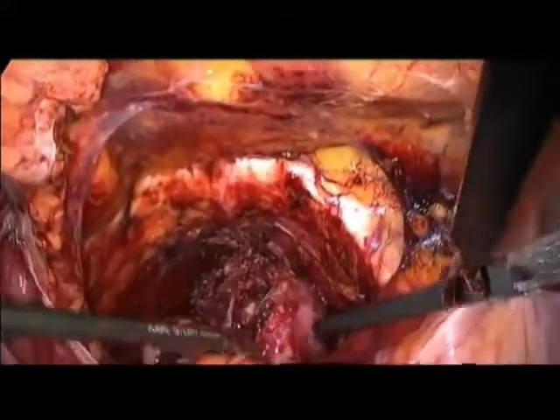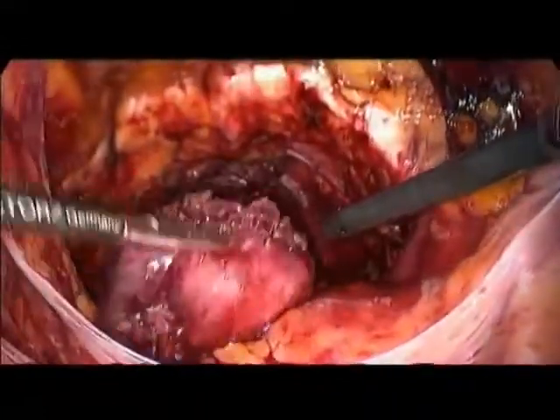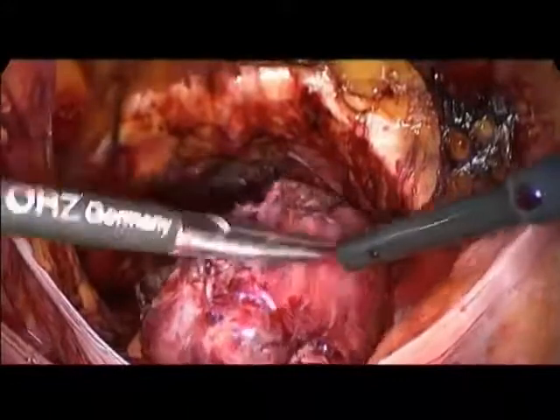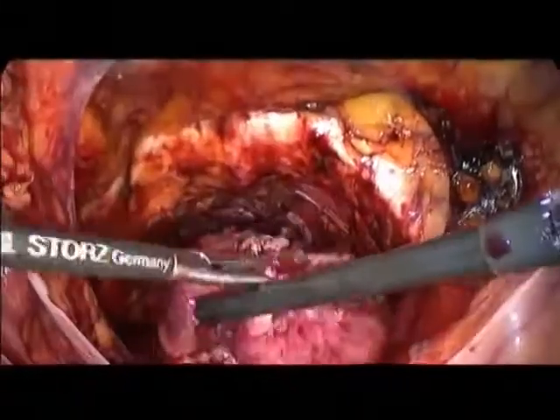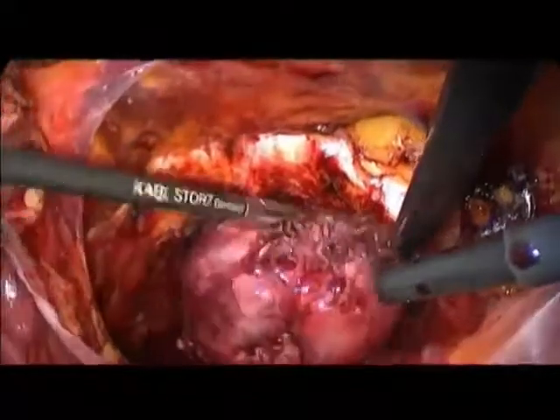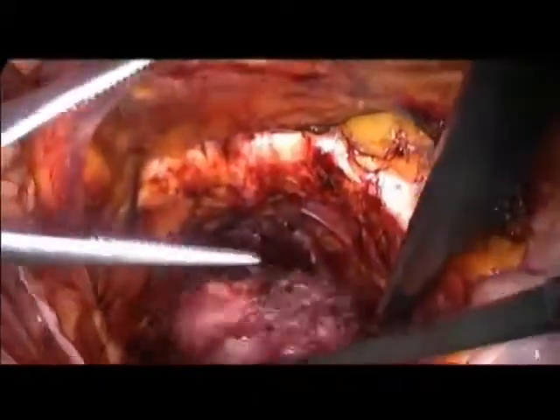Can you show the apex, please, Roland? We will have the prostate out later, after. Okay, Vito wants frozen section, so that we will open first, take it out, and then move back to the anastomosis.